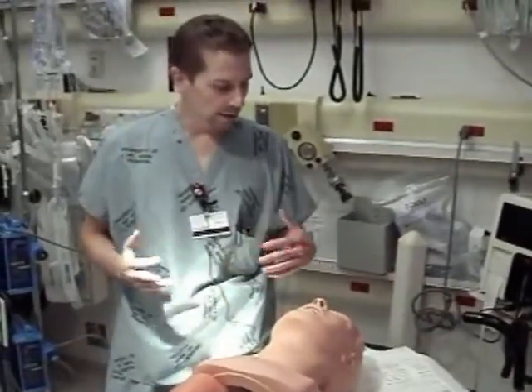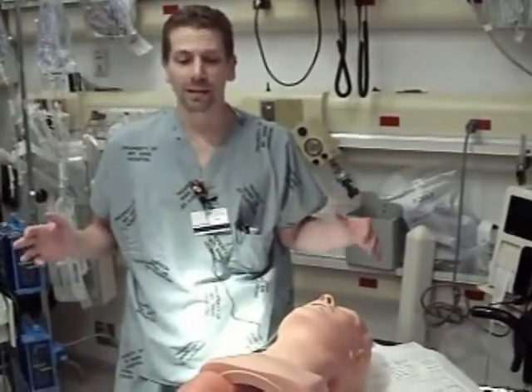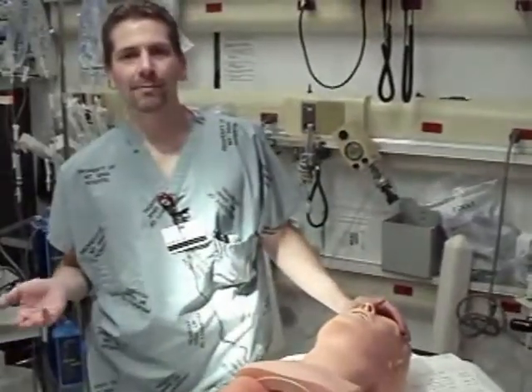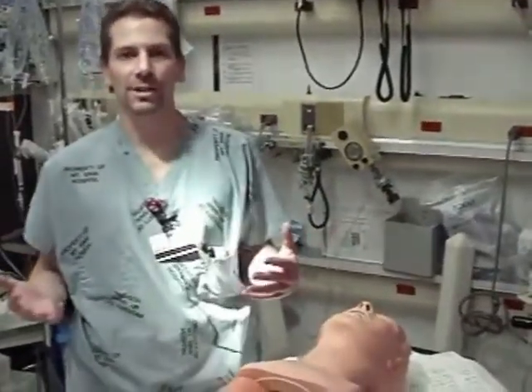So let's get started. The first thing we're going to talk about is positioning the patient. There's been a lot of confusion perpetrated throughout the years, and most of that confusion comes from what is sniffing position.